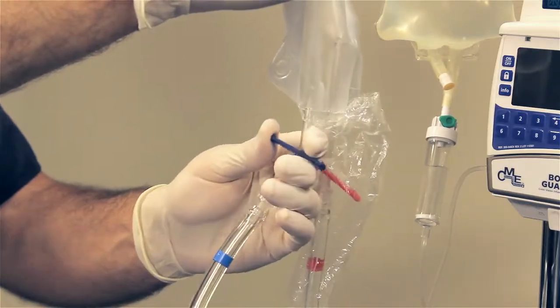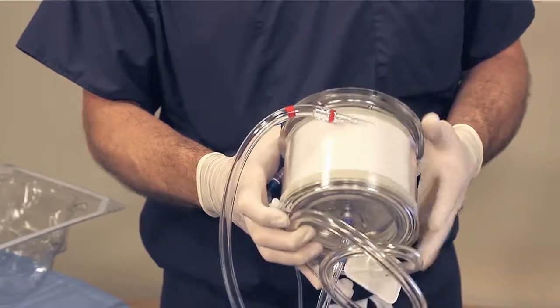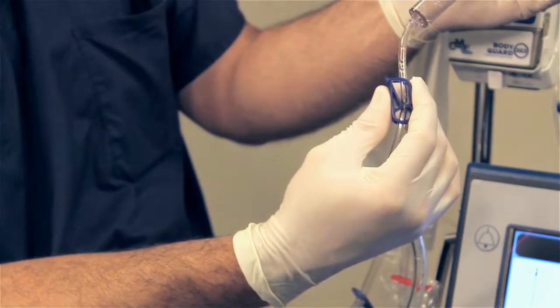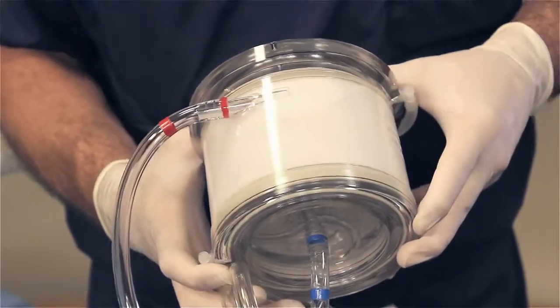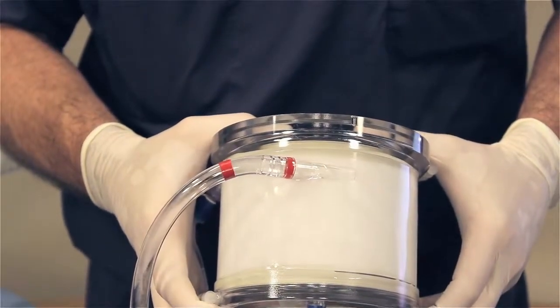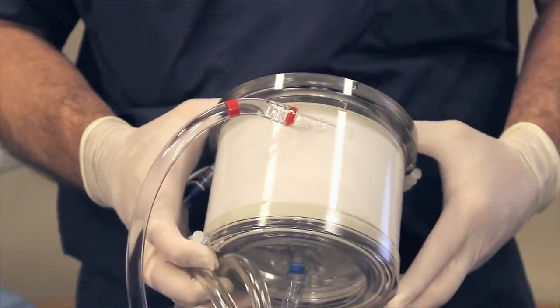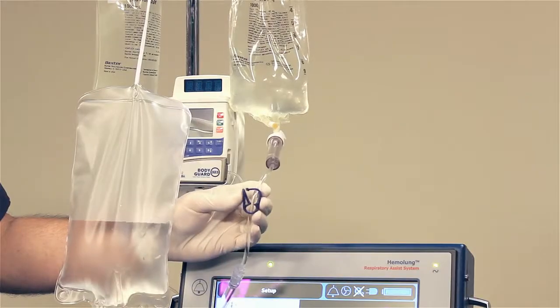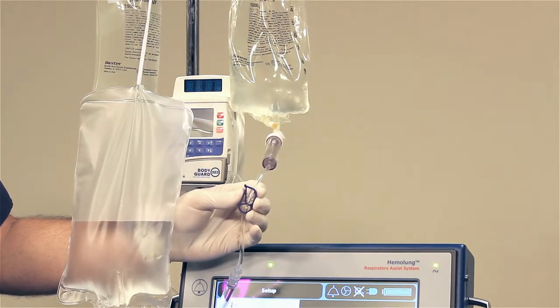Fill the drip chamber. Close the blue slide clamp on the recirculation bag. Prime the cartridge by holding it upside down with the red outlet facing up. Open the blue clamp near the priming spike to start the flow of saline into the circuit. Gravity will allow saline to move through the tubing and cartridge. Fill the cartridge by keeping the red port up and the entire cartridge below the saline bags. Once the circuit is filled with a minimum of 500 milliliters, close the blue clamp on the blue tubing set.